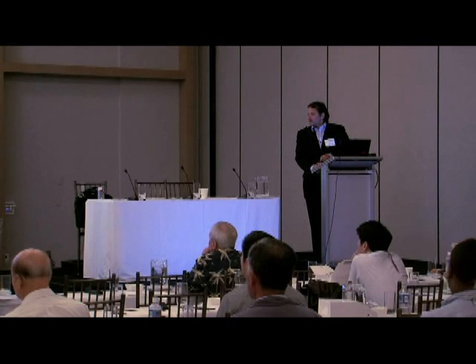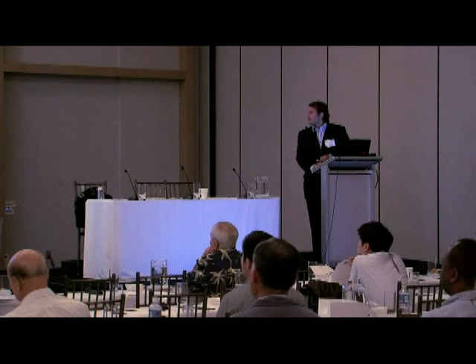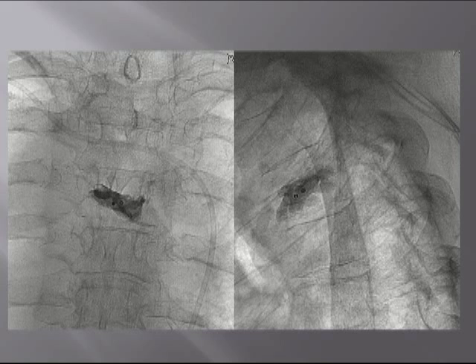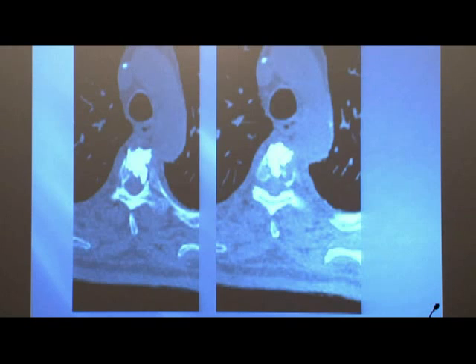At the end, our balloon was stuck, so we couldn't take it out. We just broke it off and left the balloon inside the cement, which we have done in the past as well. It dissolves, it burns out with the heat, and so this is the result.